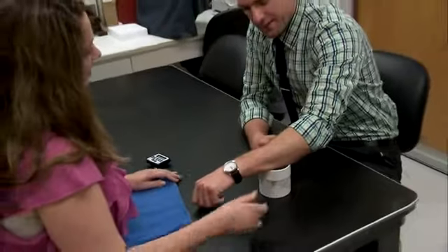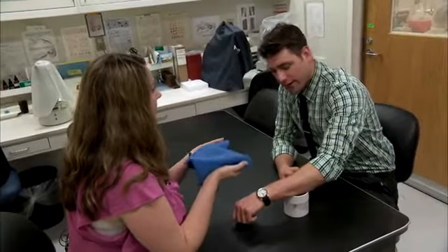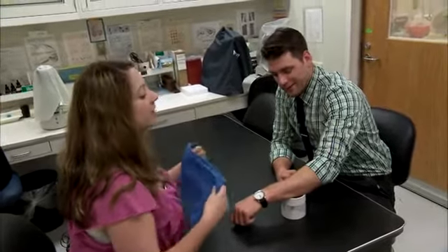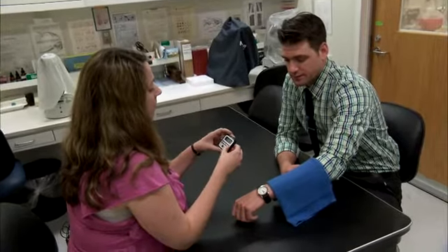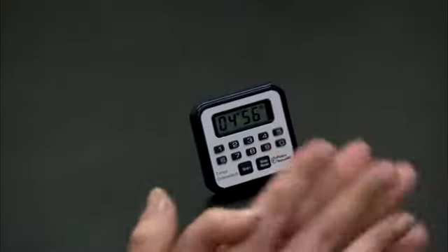So you're going to feel the mosquitoes start to bite you. We're going to put this towel over your arm. They're biting already. Yeah, they like to bite in the dark, so hopefully it's going to get even better. And we're going to give you 5 minutes for this to happen. Ready? Okay. Start. Your 5 minutes goes. Okay. We got it.